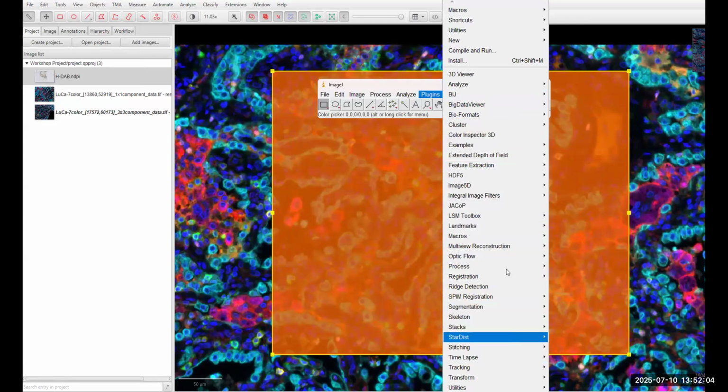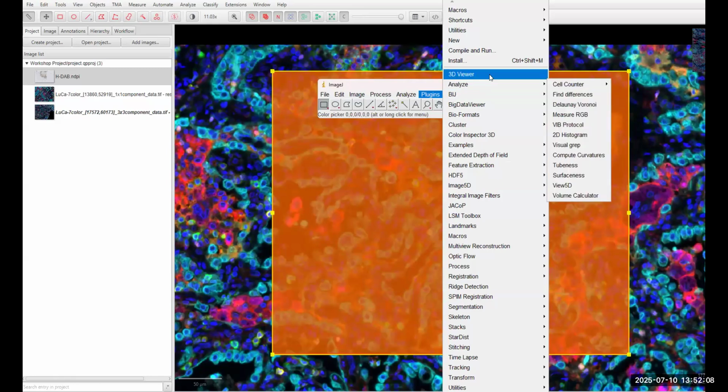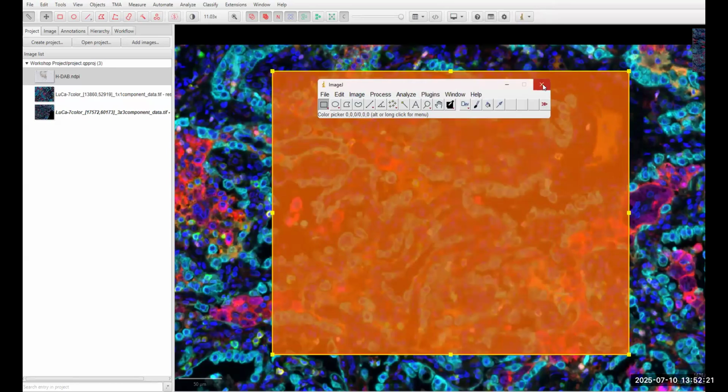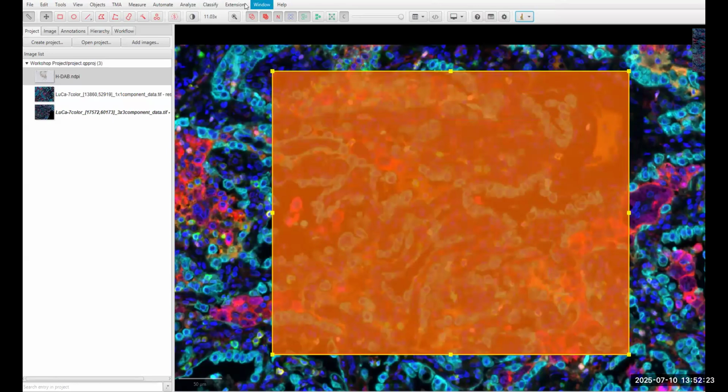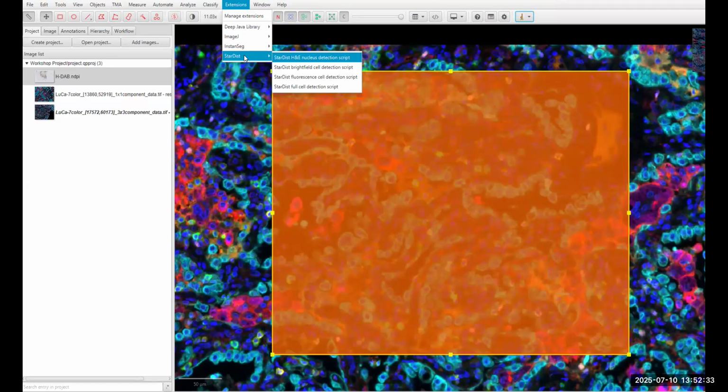for Fiji. Now, the one thing that I have found when I've been doing this that doesn't work is StarDist. StarDist is our AI nuclei detection algorithm, which we use in Fiji. But as of version 0.6 of this, it actually has StarDist installed. So you can actually use StarDist to detect nuclei within QuPath rather than sending it off to Fiji.